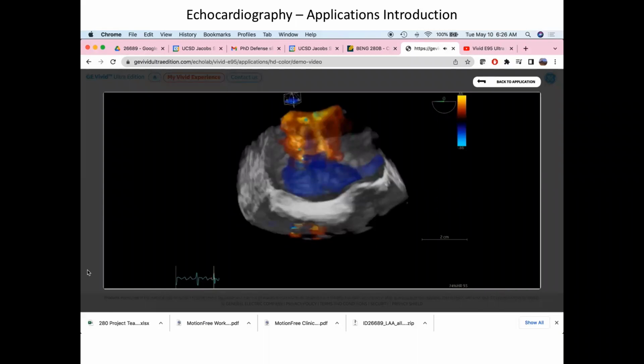If you had a smart algorithm that looked at the EKG and did a running calculation of the probability of when the next QRS is coming, which is conceivable, right? I mean, it is random, but there are patterns. Then you could say, okay, this is the most opportune moment to scan. And then sometimes you just give up and say, I'll just scan for a second. Whatever happens inside that second, that's our data, you know.